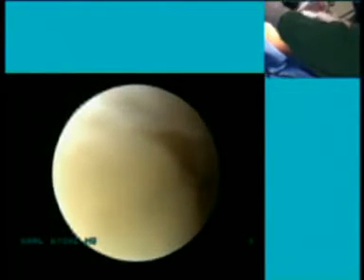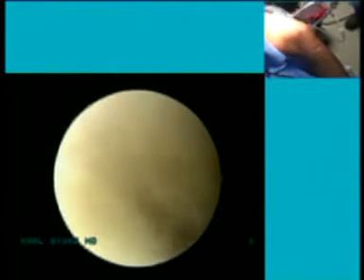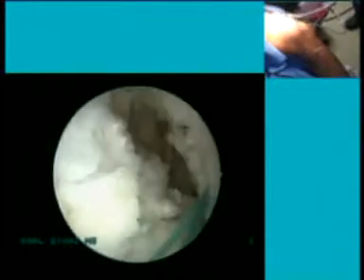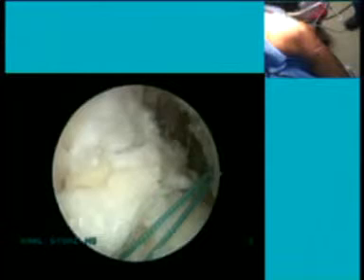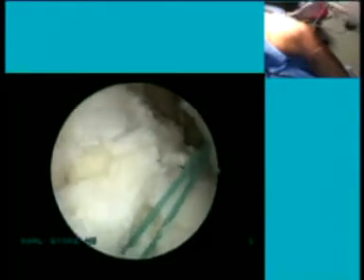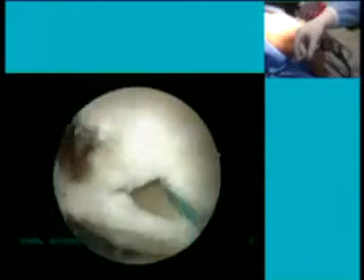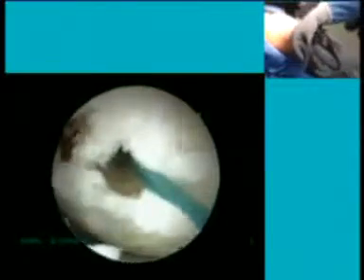Dr. Wolf, you have just passed the suture leader in the PL tunnel or the AM bundle? Dr. Wolf, can you hear us? Yes. Can you take us through this, as we were discussing the merits and demerits of double bundle while you are passing your sutures? Is this suture through the PL tunnel or the AM tunnel? This is the PL. Okay. Can you trace it down to where it goes in the femur? The PL first. Now we can see it much more clearly. So the medial portal gives a far better view, isn't it? Yeah. Please continue.